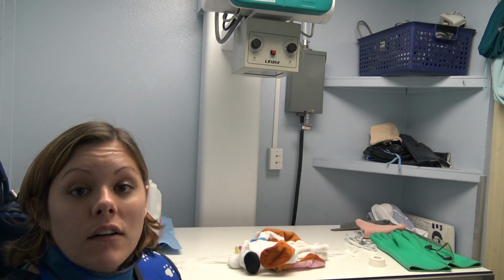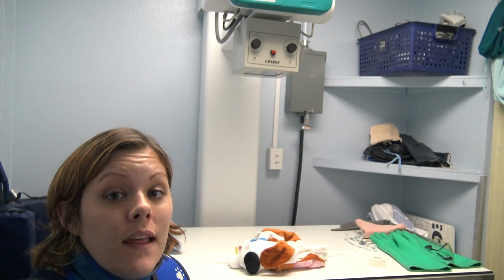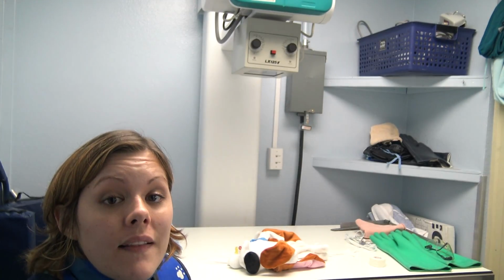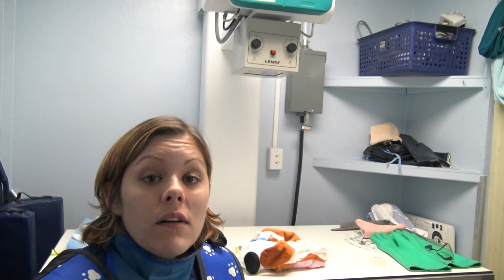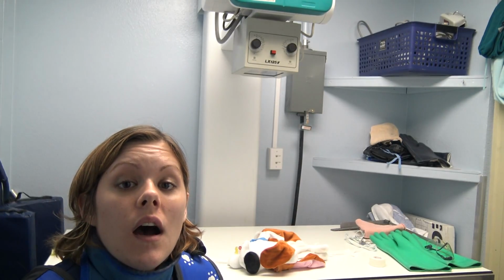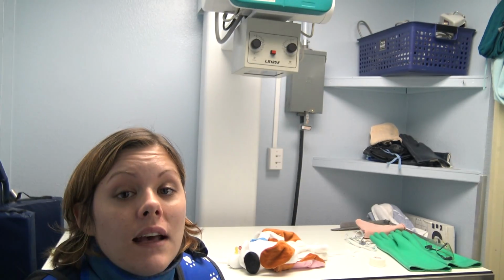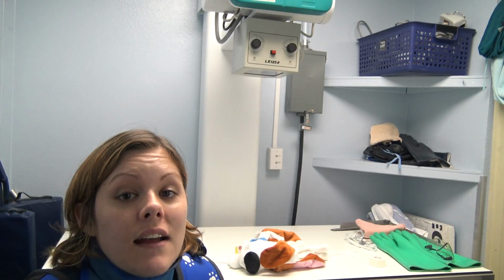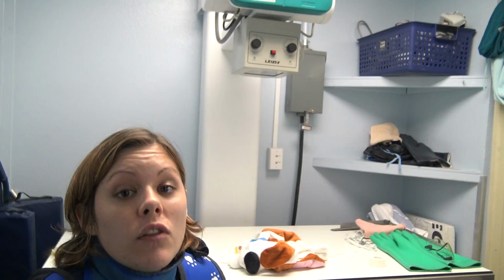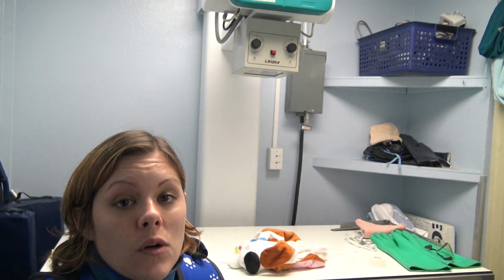do our first scout film on the right lateral side, and then we will administer the barium and follow up with an x-ray, right lateral and VD. If this was a real barium study, you would be doing 4 scout films, so that would be a VD, a DV, and a right and left lateral film. Then you would take a VD and a lateral at 15 minutes, 30 minutes, 60 minutes, and then every hour until it reaches the colon.